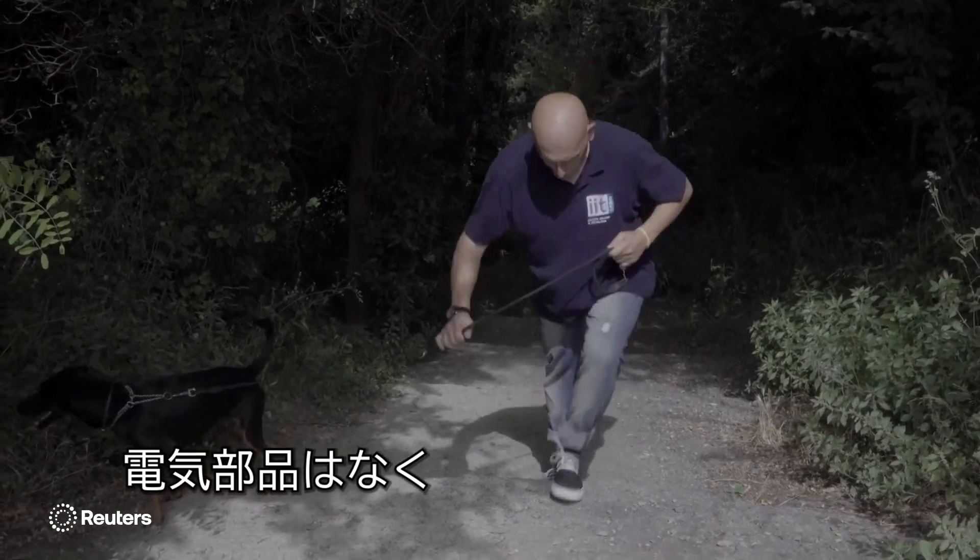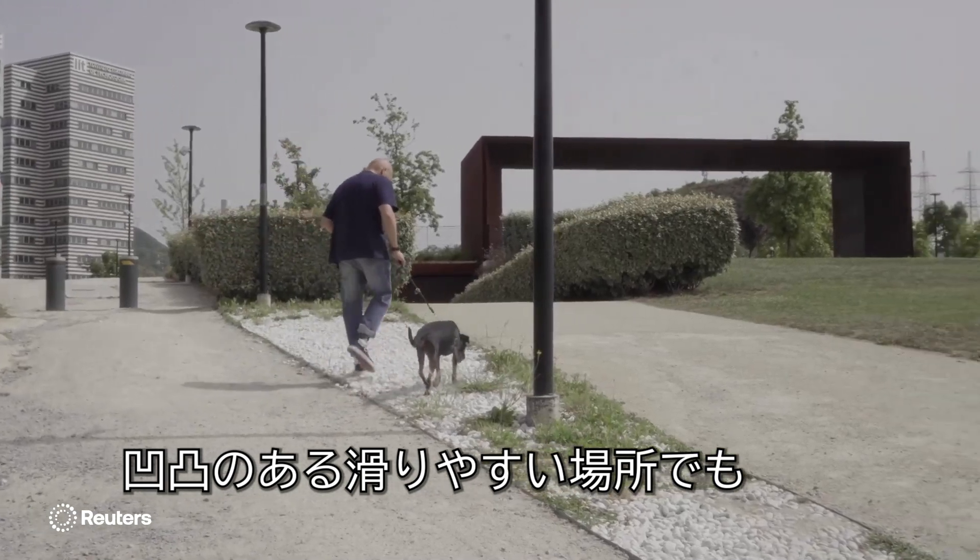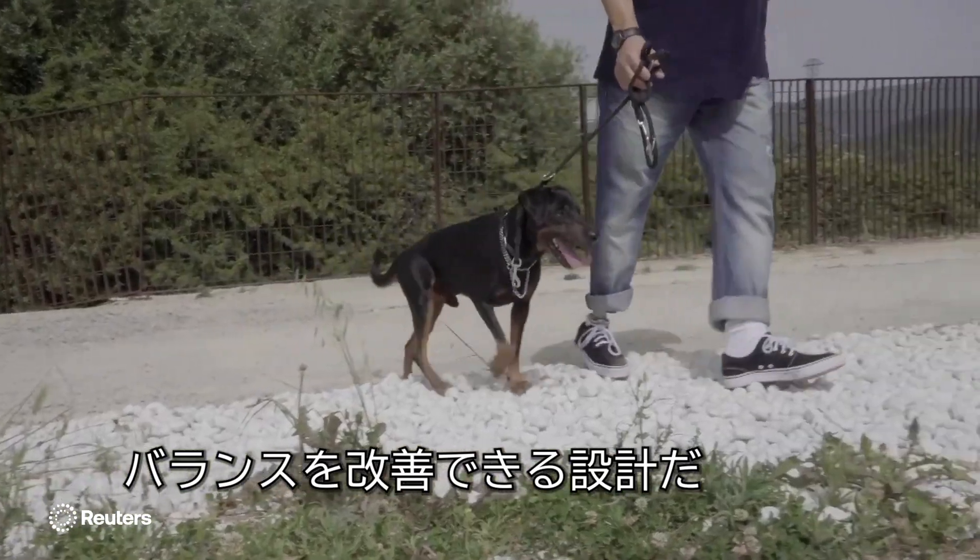The SoftFoot Pro has no electrical parts and was specifically designed to help improve the user's balance on uneven and slippery terrain.